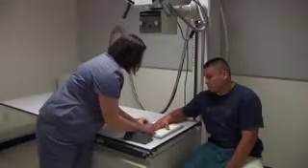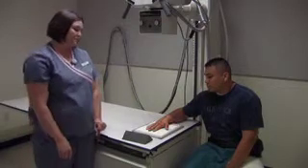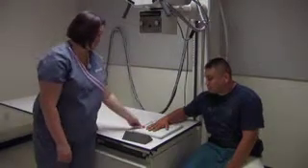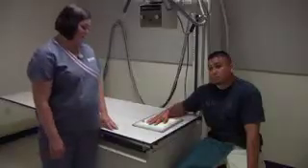You want to have a little bit of light in between each of the fingers. Can you please bring your fingers together for me a little bit? Not so much, just a little bit. There you go, good. You want to place your marker to the lateral side out of anatomy. For the PA projection, you also want to get from the tips of the fingers through the carpal bones. So you're including the entire hand, the hand in its entirety.